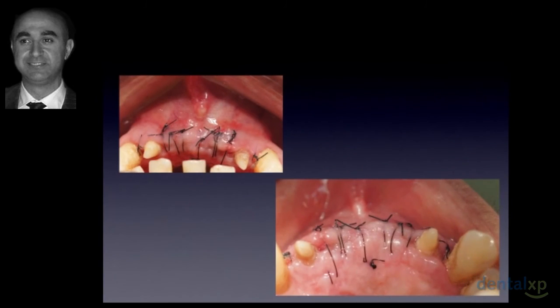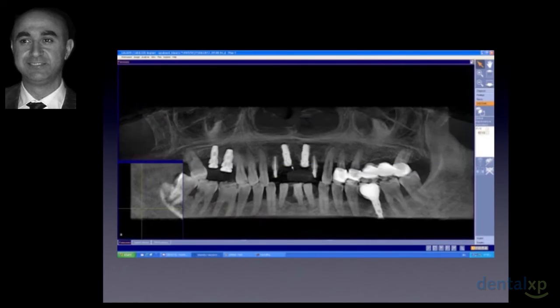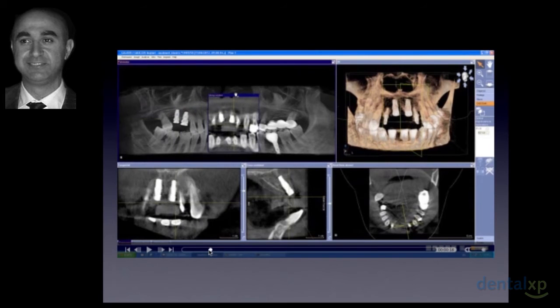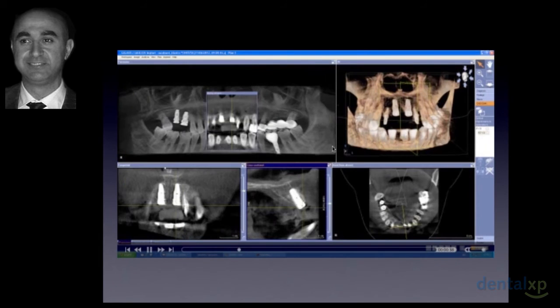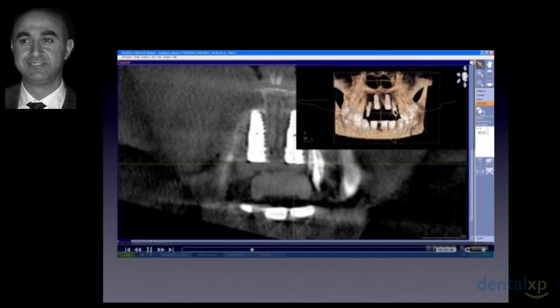After 1 week of healing following placement of the implants, everything looks fine. Again, just a short video of the cone beam CT after placing the implants. As you can see, the placement of the implants follows the stent itself. If we move further faster and take a cross section of the implant, you can see the amount of bone labial to the implant, which is around 1.5 to 2 millimeters, which we need in this area. And as we said before, we have the Laser-Lok microchannels, which in this case doesn't worry me about any kind of soft tissue recession in this area.